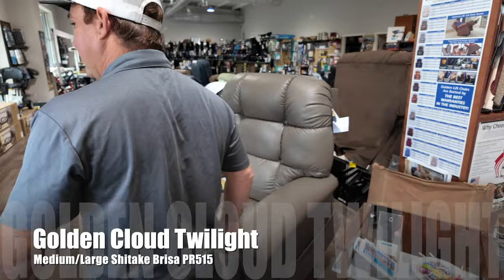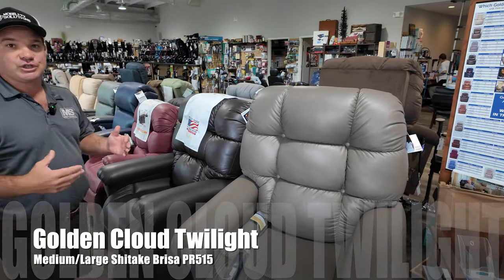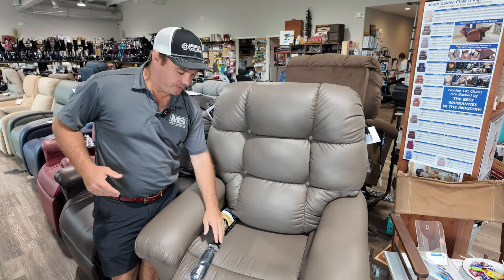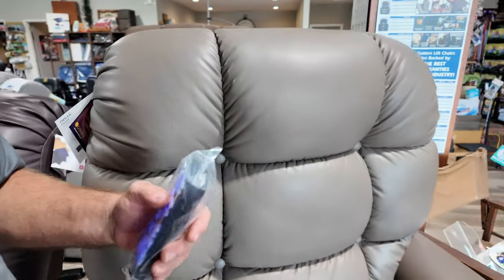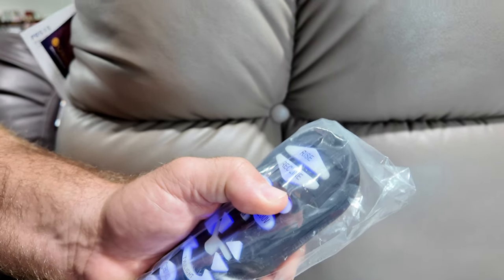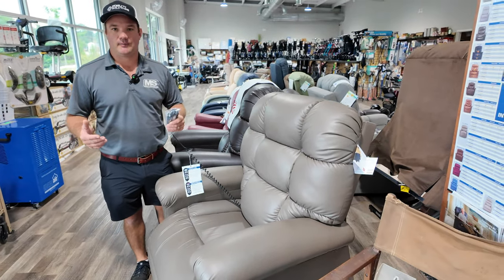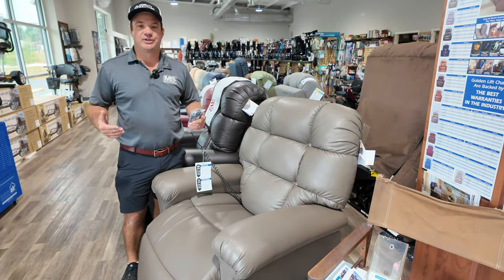This chair right here is probably one of our best-selling chairs. This is the Cloud with Twilight technology. And you're like, what is twilight technology? Golden — their famous chair, one we sold the most was the standard cloud. So what they did is they developed — they knew people needed feet above their heart. And what people had to do before is maxi comfort, turn Trendelenburg position, head all the way down, feet up, and people would buy those chairs to do it but they never really did it because they didn't want to be upside down.